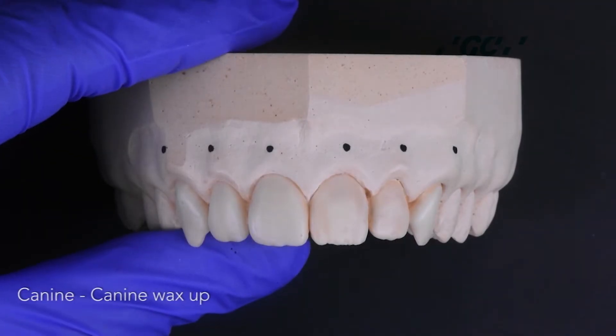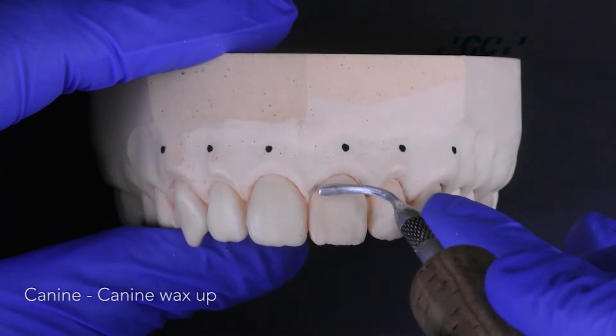Once prepped, take an alginate impression and pour a diagnostic model in dental stone. Wax up the prepped teeth on this stone model.